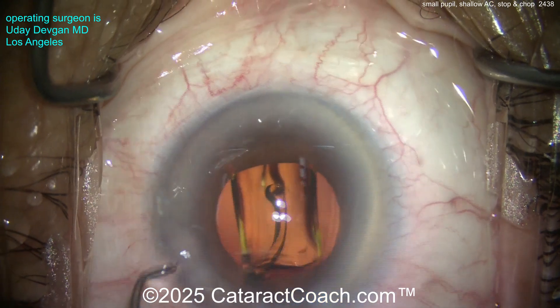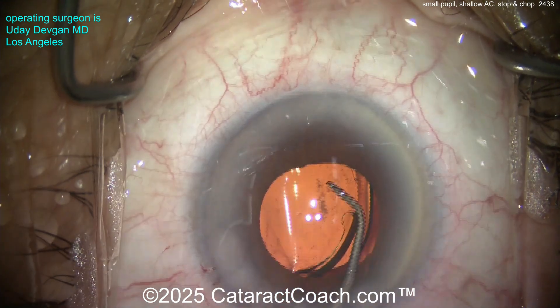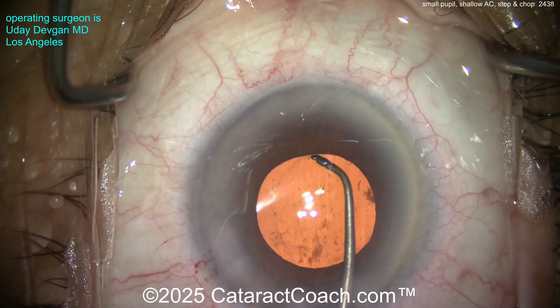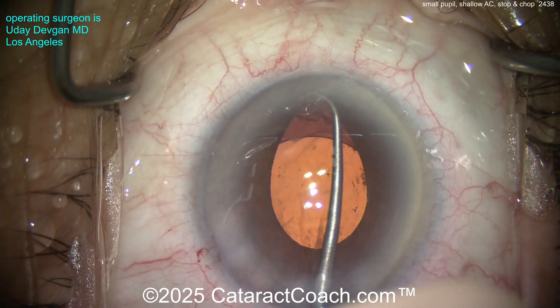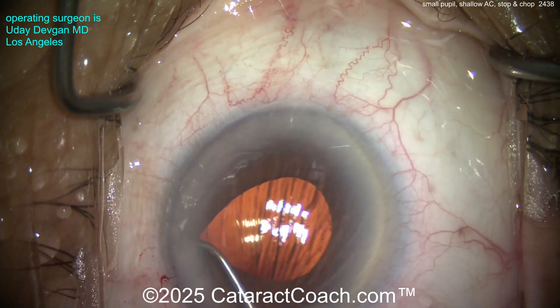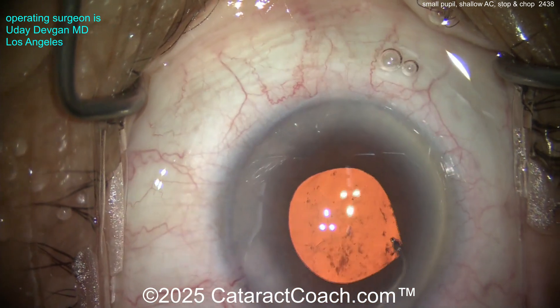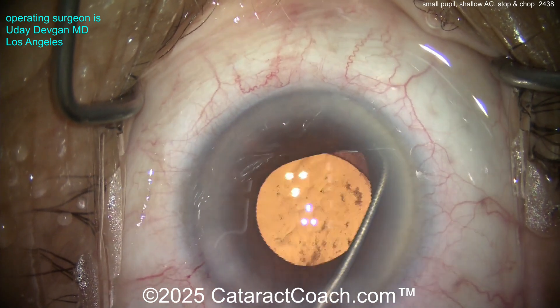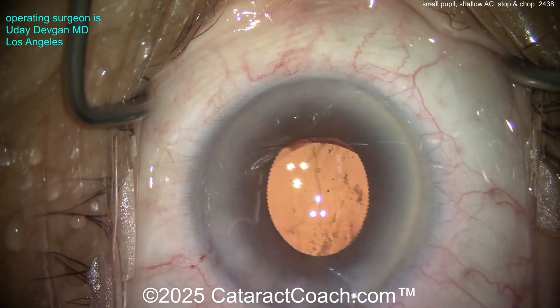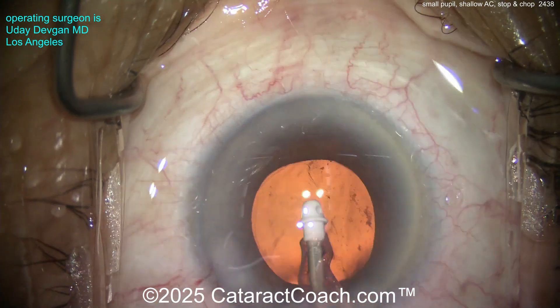So we put the IOL in the capsular bag — a monofocal lens aiming for about a plano outcome. The lens goes in nice and easy, opens up inside the eye. Now I'll ensure it's 100% in the capsular bag and behind the rhexis, and that the rest of the bag is still empty. Watch — with the eye full of viscoelastic, I'll use the chopper to lift up... and what is that? Cortex. Look at that — you missed it. I want to check all around and confirm both haptics and optic are completely behind the rhexis. Right opposite the main incision nasally — the patient has a large amount of cortex there. You can't leave that in the eye.